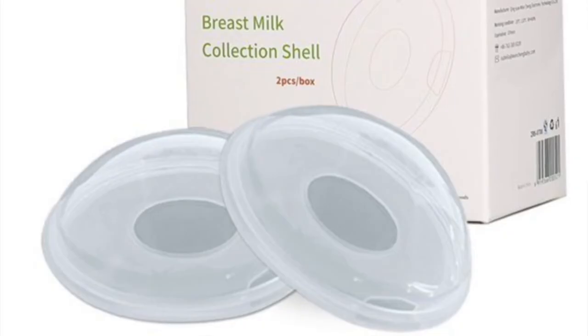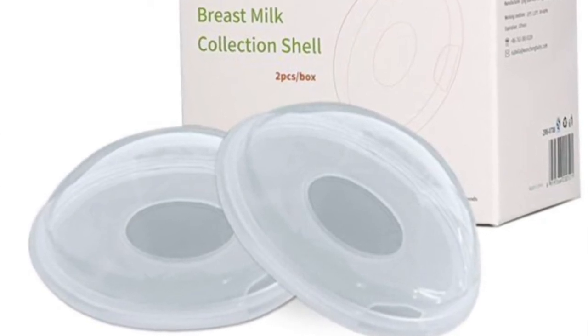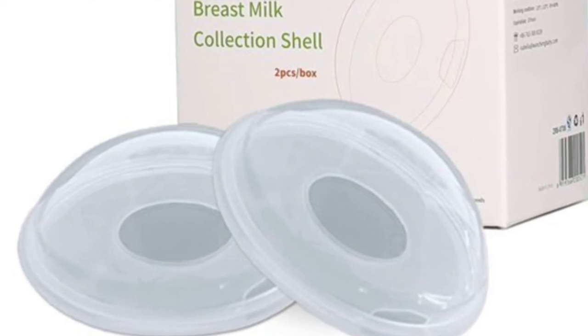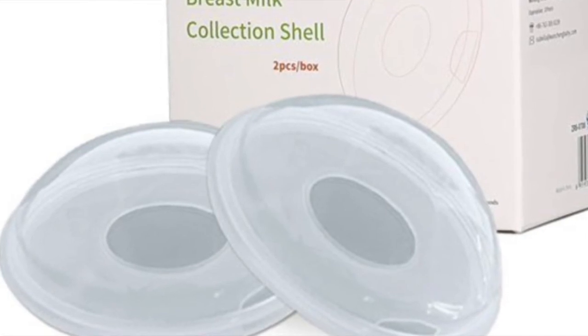Another thing people have talked about doing is wearing breast shells to help extend the nipple. The breast shell is worn under your bra and is meant to put kind of reverse pressure around the nipple to help pop it out. By wearing these over an extended period, people thought it helps extend the nipple, but I don't find this technique to be that useful. I would definitely recommend using a hand pump or supple cups instead.